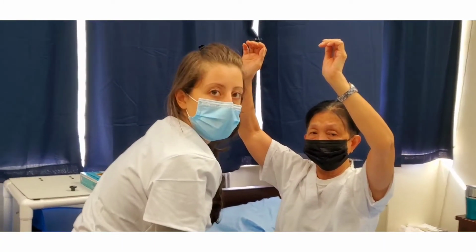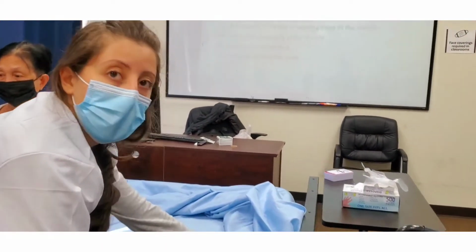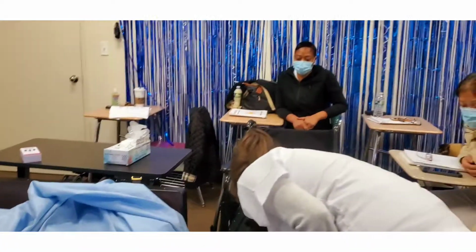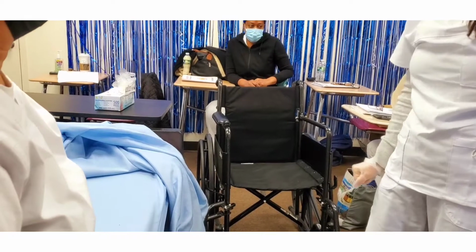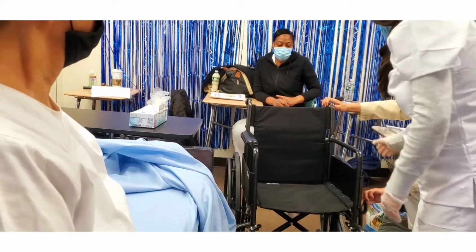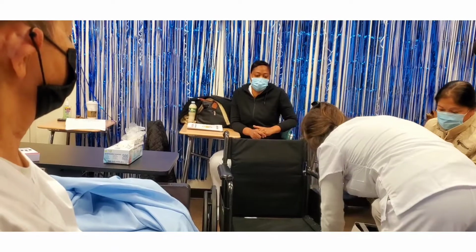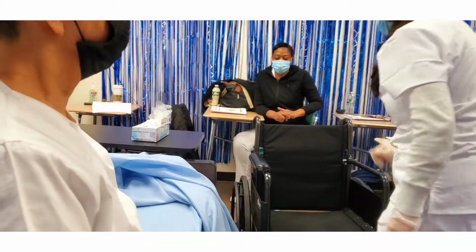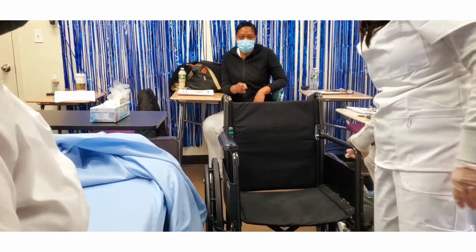So before you get her up, you have to remove the footrest from the wheelchair. I'm trying to angle the camera in a certain way so the people can see. Make sure your wheelchair is locked. You can swing the footrest away. Can somebody show Michaela how to remove it? Swing it so it's away, because sometimes patients get stuck. Check that it's locked before you get your patient up. We locked it, yes. Okay, go ahead, Michaela.